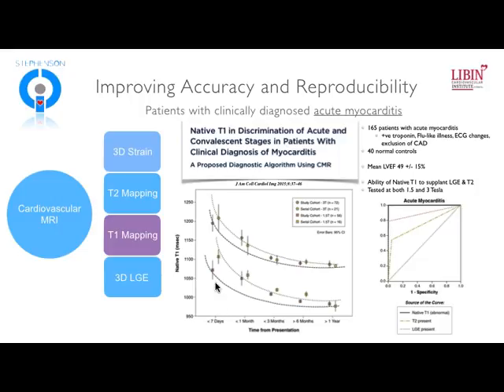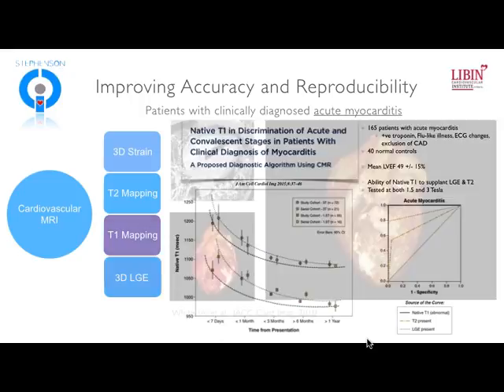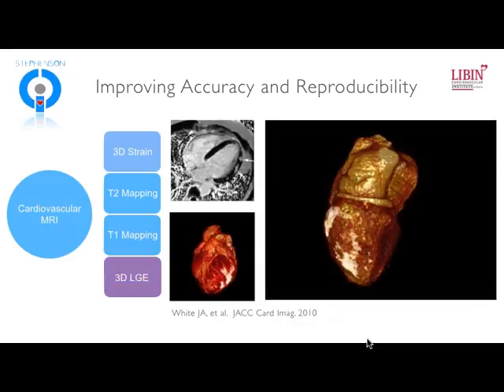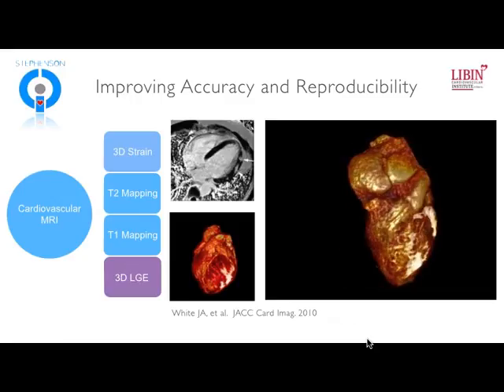But one of the nice figures in this publication is this one. And what they show very nicely is both at 1.5T and 3T, the steady decline in T1 values that occur over time, with normalization by approximately 6 months. And so this is actually a very nice figure that I think that promotes the use of T1 mapping as a quantitative serial measure of trying to look at resolution of myocardial inflammation.